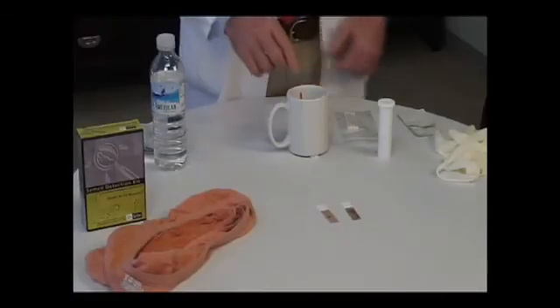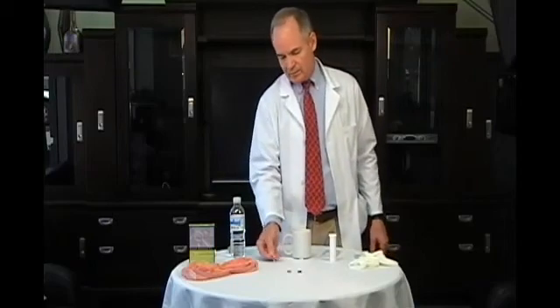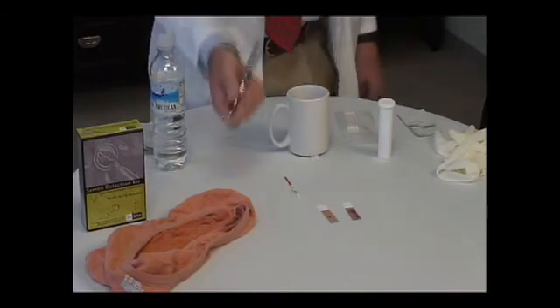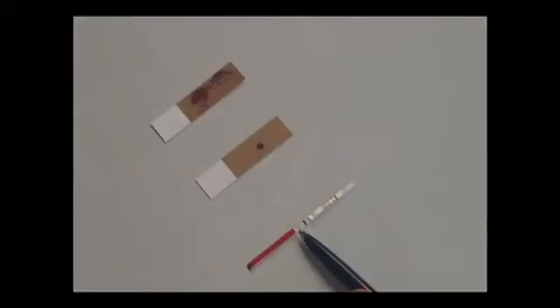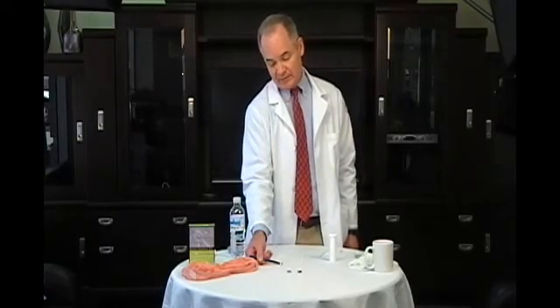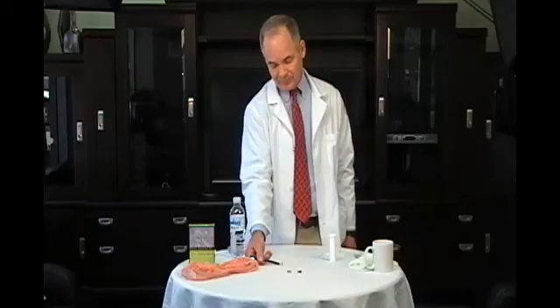Well, it looks like we have a positive test. What we have here are two red lines on the test strip. The top red line is the control line. It always comes on no matter if the test is positive or negative. This line indicates that the test is successful, whether negative or positive. The bottom line is the test line. What it indicates is the presence of prostate-specific antigen.